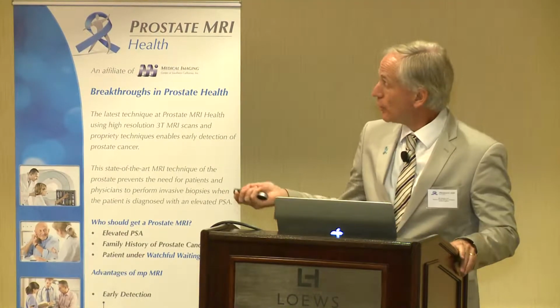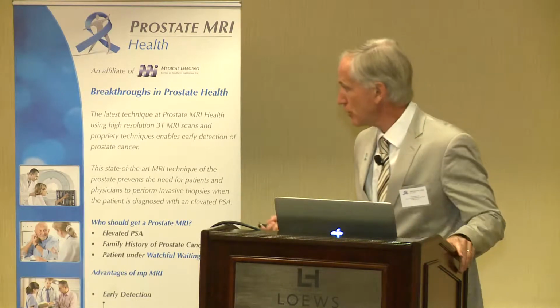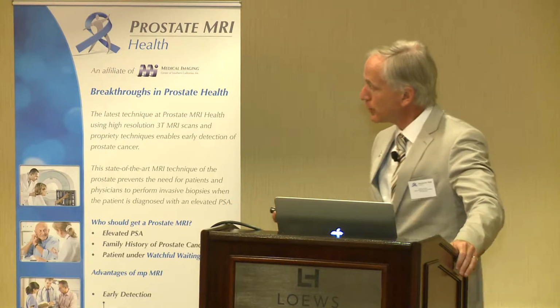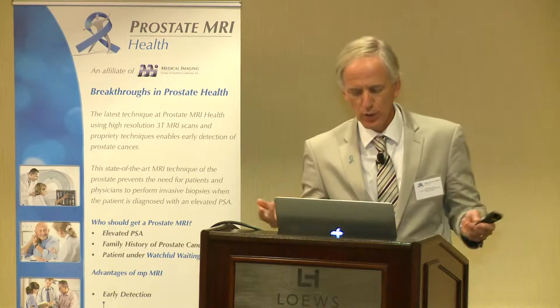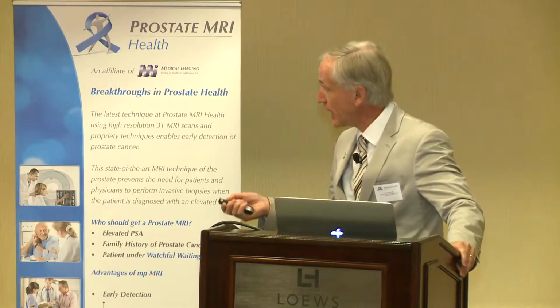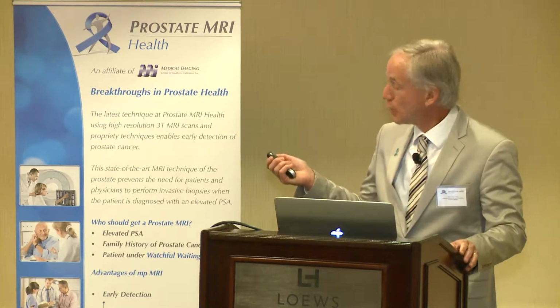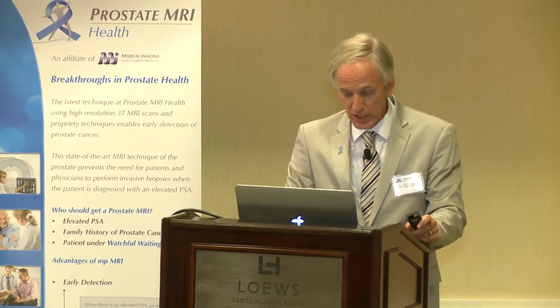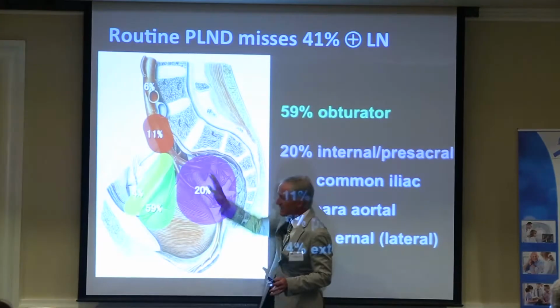However, nice studies. Sensitivity increases with this technique. Fantastic. However, there were some problems with the registration and financial issues, an economic crisis, and as of April the 1st, 2010, Combidex did not exist anymore. Now, first let's consider what we learned from the nice time that we had Combidex. We learned that routine lymph node dissection, the green area, is the area where the urologists are finding lymph nodes. In the rest, it is difficult. So positive lymph nodes were missed in about 40%. Deep in the pelvis, behind the common iliac vessels, that's the tricky area even for a urologist. And urologists are now considering extended lymph node dissection, removing everything here in the pelvis, but that has risks.